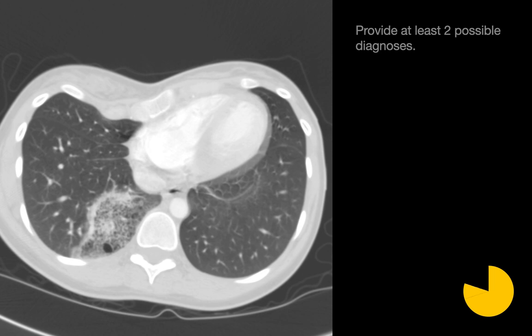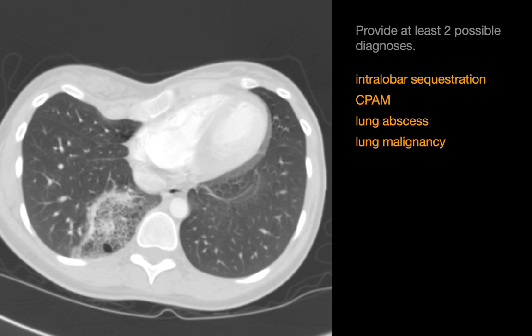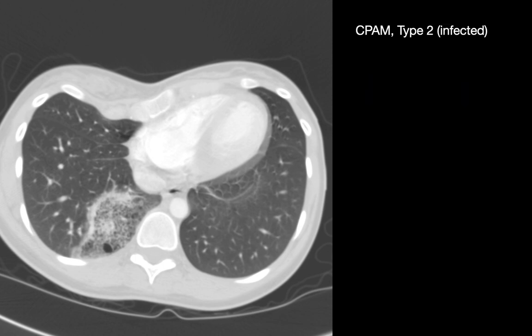Provide at least two possible differential diagnoses. Within the right lower lobe, there's a region of bubbly lung that reminds us of a dishwashing sponge. The two primary differentials are an infected intralobar sequestration or an infected CPAM. It's difficult to differentiate without visualizing a systemic artery. Two additional differentials to consider are a lung abscess or lung malignancy — specifically a lepidic subtype adenocarcinoma, which can sometimes look similar. This particular patient had a type 2 CPAM that was infected.